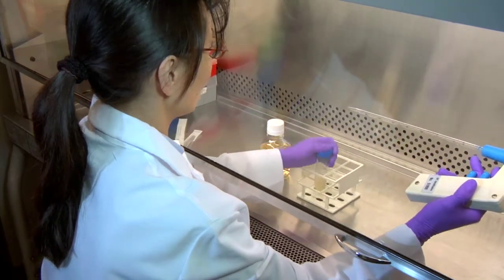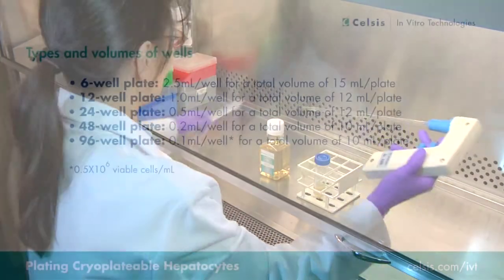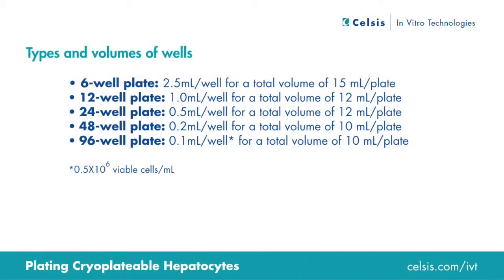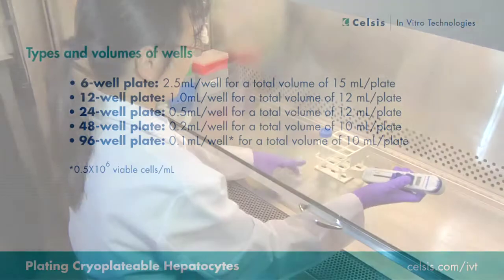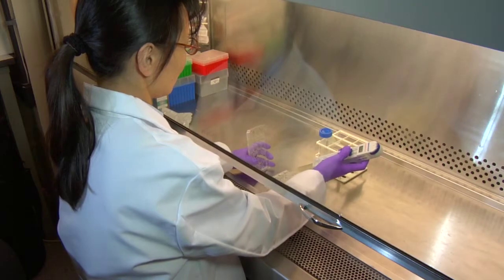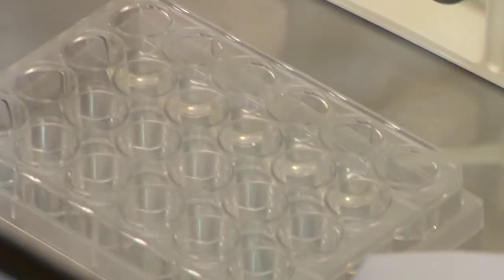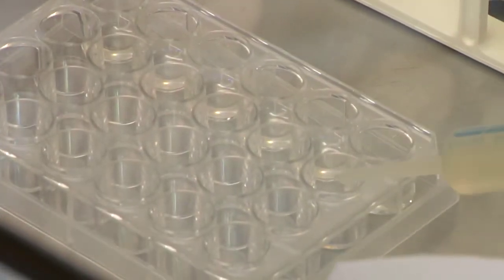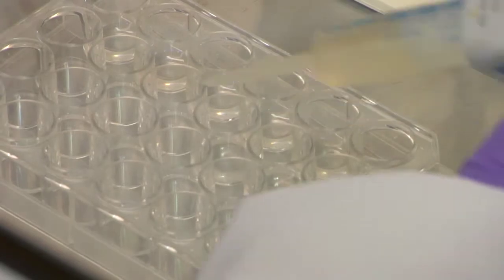The cells are now ready to be plated. Typically, cryoplatable hepatocytes are plated on collagen-coated plates. Other matrices like Matrigel can be used. The volume for each well will depend on the plate format you use. For induction, a 24-well plate is commonly used with 0.5 milliliters of cells aliquoted per well.